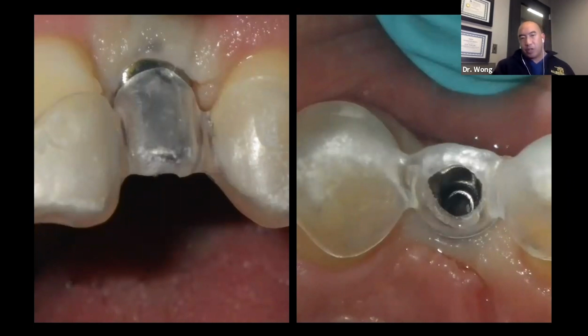Second of all, as you're inserting your driver through this seating jig into the abutment, you can see once again this is just the abutment. Okay, this is not even the crown, just the abutment. But you can see that the tissues are blanching like crazy, and once again the patient is hurting. Right, you can even see on the right side of the screen, look at the tissues blanch on the palatal side. The patient is hurting. This is not something we want to do. It's not kind to the tissue.